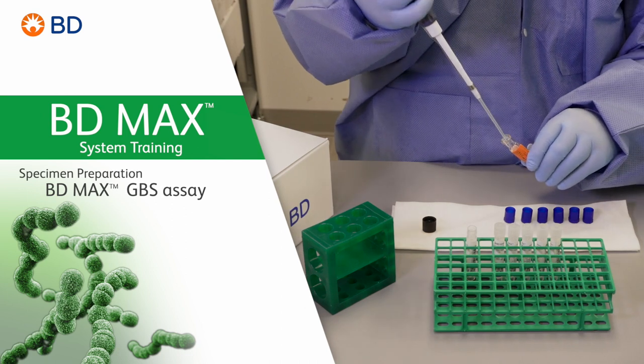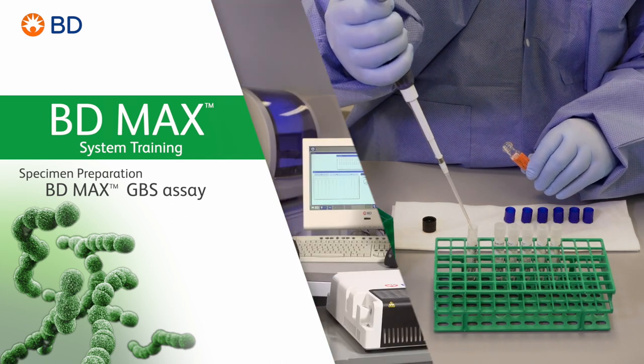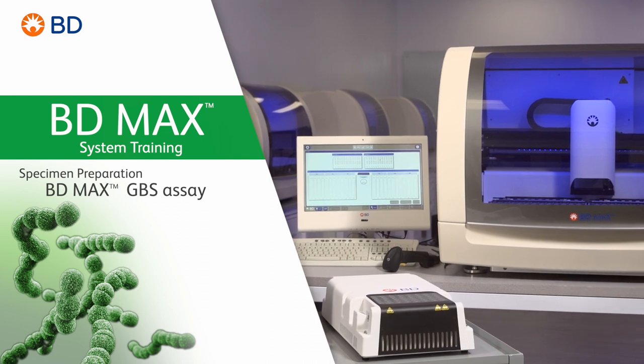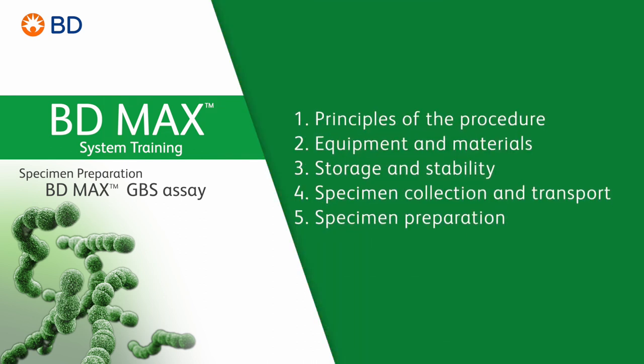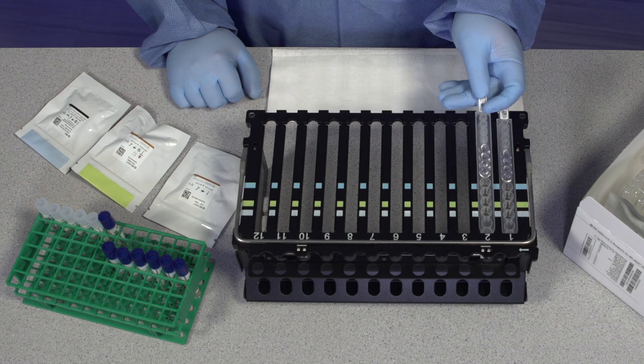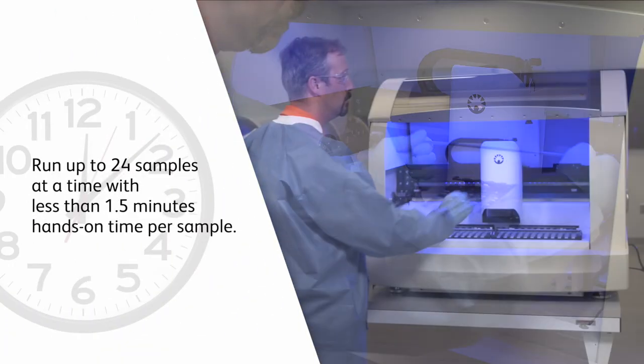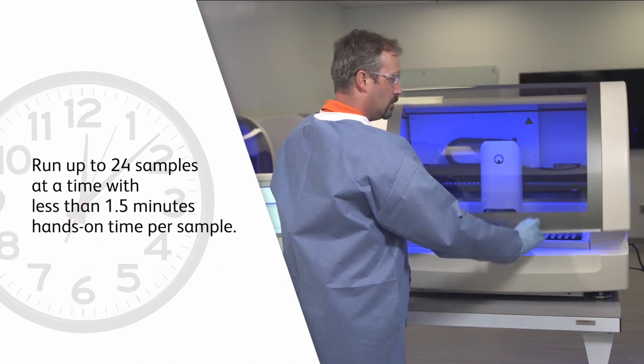Welcome to the training video on the basics of proper sample preparation for BD-MAX GBS assay, processed on the BD-MAX system. The BD-MAX system offers you a simplified and automated workflow, allowing you to run up to 24 samples at a time, with less than 1.5 minutes hands-on time per sample.